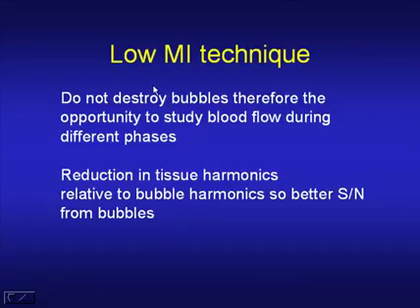The low mechanical index technique gives us a much greater opportunity to study blood flow during the different phases. In fact, we can scan continuously for several minutes through the volume of a tumor, and hence we're not looking at phases but a complete dynamic examination.